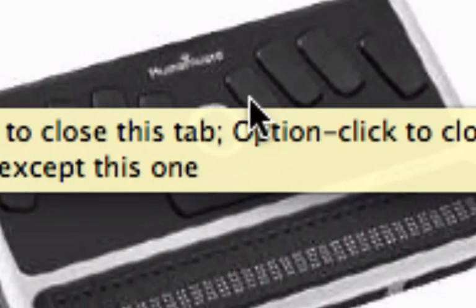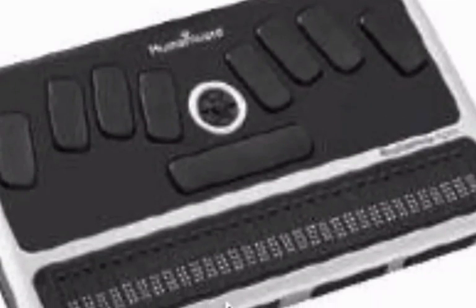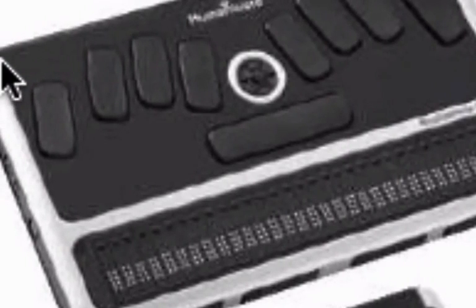So does this. This is a piece of hardware called the Braille Note Apex. And for those of you who are not familiar with this technology, in layman's terms, you can think of it as a laptop for the blind. It talks to you. It's everything you would expect in a typical day-to-day organizer. You have a date book, a phone book, a calendar, an alarm clock, but you've also got things like a web browser, and this particular iteration of the product has built-in wireless. The catch is that all this equipment runs Windows.